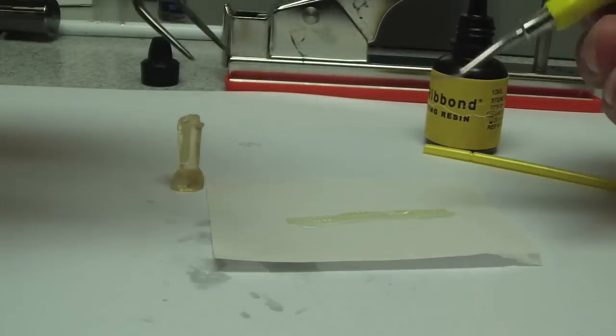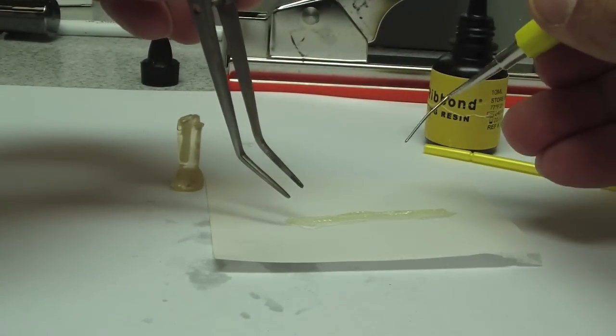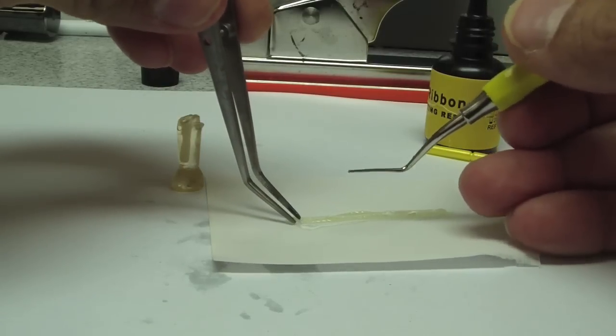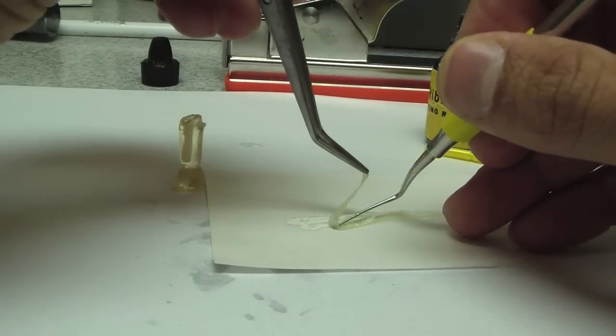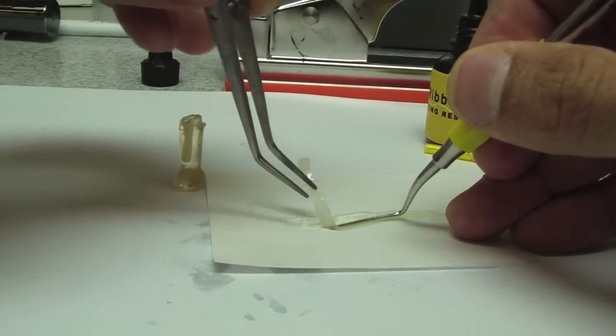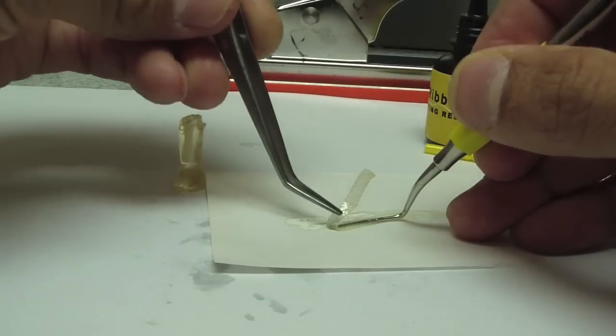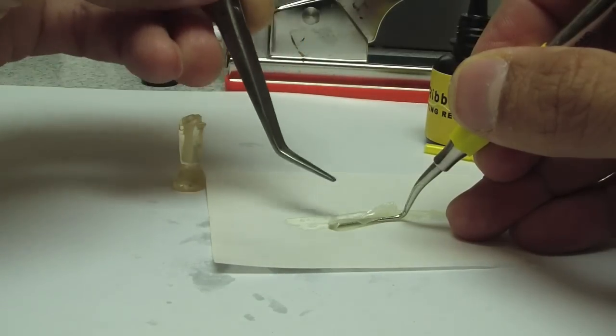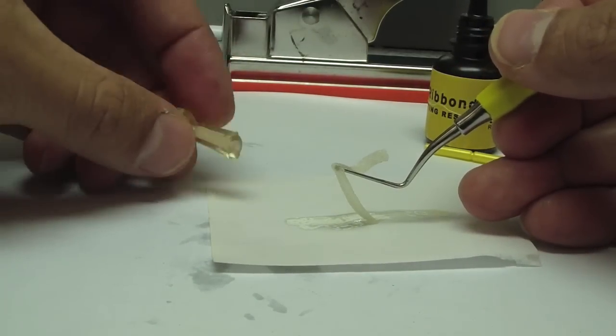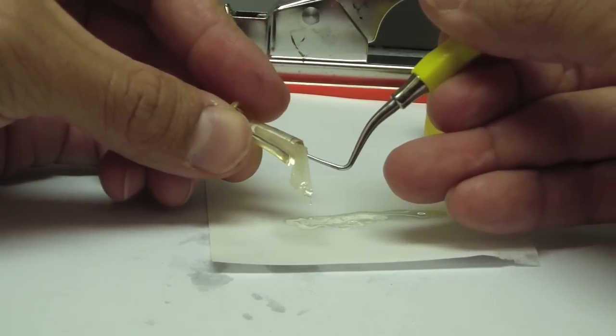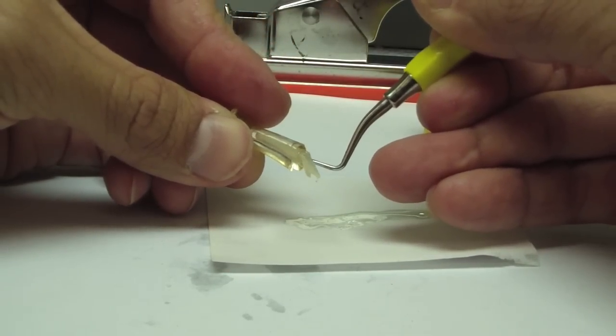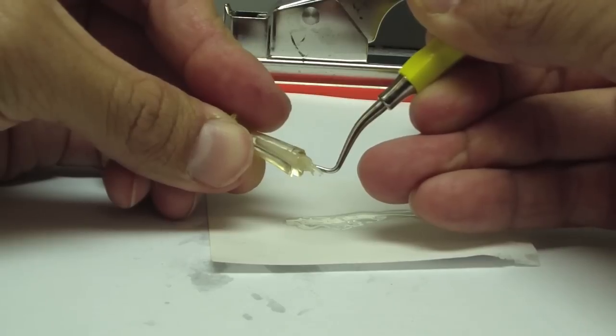Like I said, I would dab this off a little more. You can see it's already curing even though it was covered—it cures really fast. You could place a little bit of composite onto the placement instrument to better pick up the ribbon. Now I'm just going to initially place it apically and then attempt to condense the remaining strand.